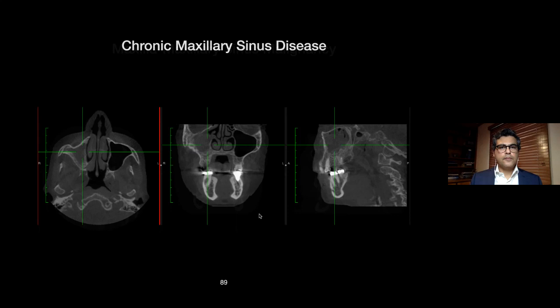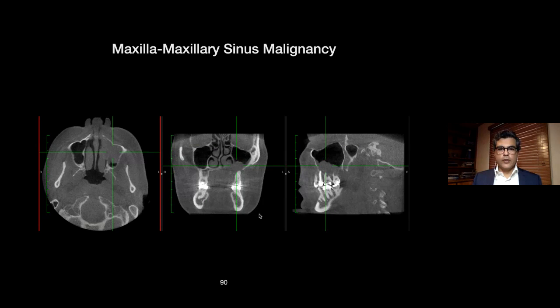Now, if you look at this image here and this image, they look kind of the same. But if you look closely, this specific patient, a 45-year-old male, this case was referred to me by a sleep apnea specialist. The dentist has limited their practice to treating sleep apnea, and so he took the scan to look at the patient's airway. But then the task-specific evaluation was the evaluation of the airway. And then I got the scan for the full evaluation.